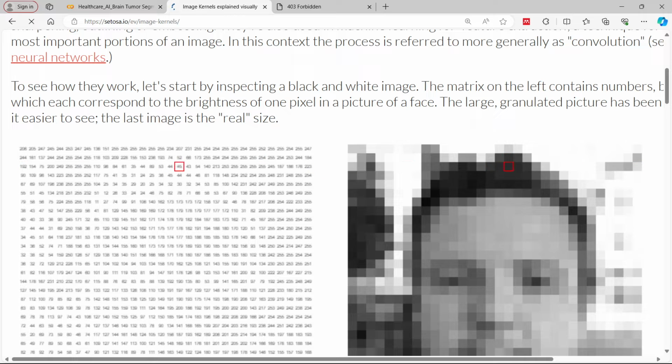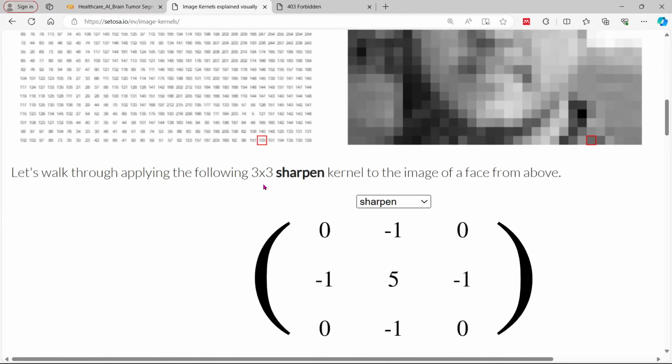If you have 0 everywhere, that is black, right? Can you see, if it is very black, the number is around 20, which is approaching 0. If the number is white, it is approaching 255, right? Does the concept make sense to you?